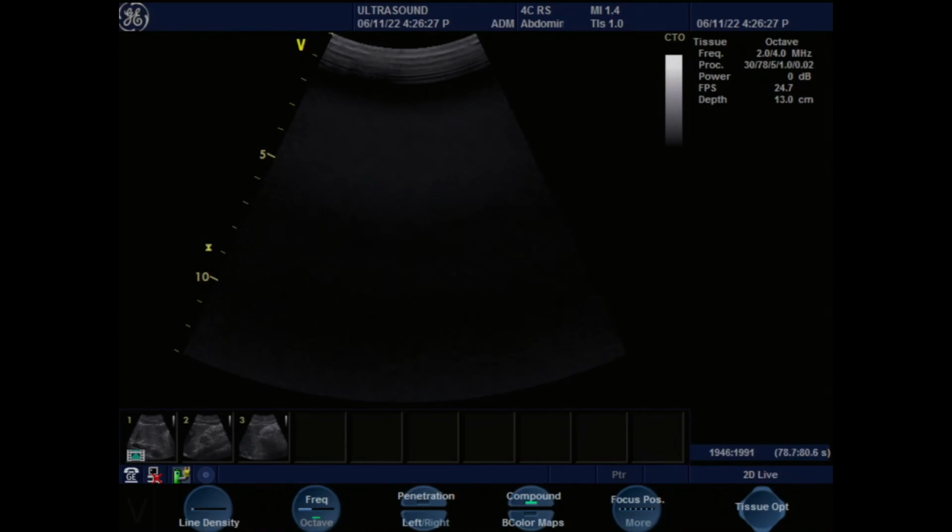All right, are you left-handed? Would you prefer to scan with your left hand? My hand's equally coordinated. Okay. Most left-handed sonographers do scan with their right hand and use their left hand to touch. So, the ultrasound probe has the notch that I was telling people about. This is head or his right side. You put the gel first, then you put the probe on the belly.